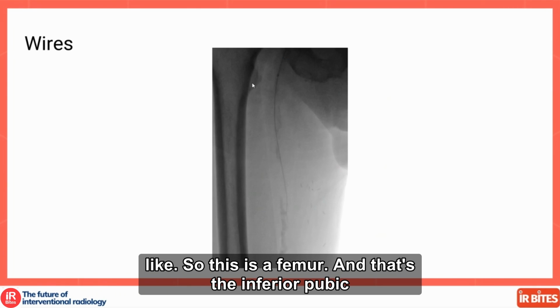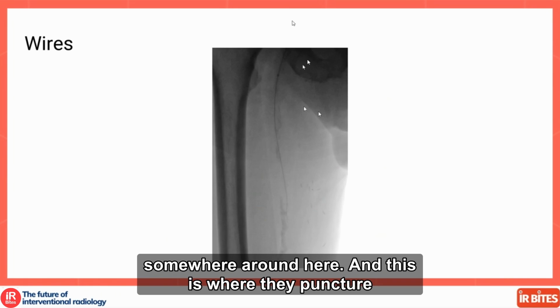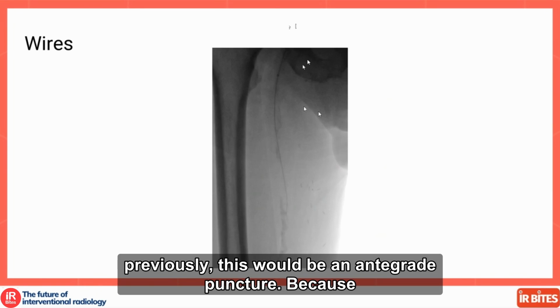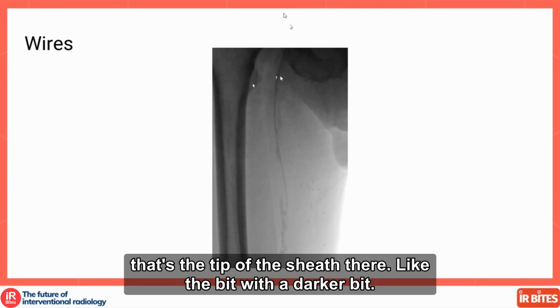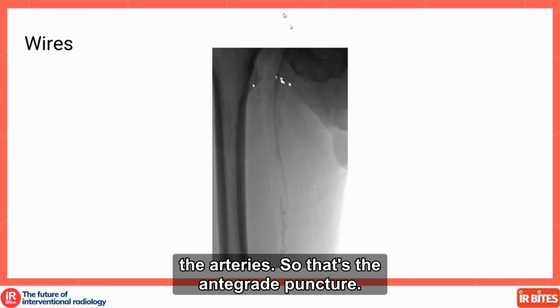So this is a femur, and that's the inferior pubic ramus. If you imagine the head of the femur is somewhere around here, and this is where they puncture the CFA. As a quick recap from previously, this would be an antegrade puncture, because that's the tip of the sheath there, the bit with the darker part. It's in along with the blood flow in the artery. So that's the antegrade puncture.